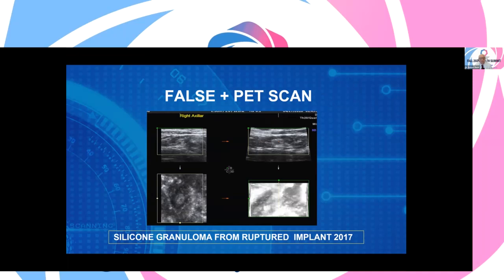which shows up nicely. But granulomas show up on PET scan as an abnormality because it's not normal tissue. We see this with fillers in the face all the time. People will come in for glands in the neck, and you ask the patient, well, what's going on? What kind of treatment have you had? Or are you exposed to toxins or parasites, which are an increasing problem also these days?